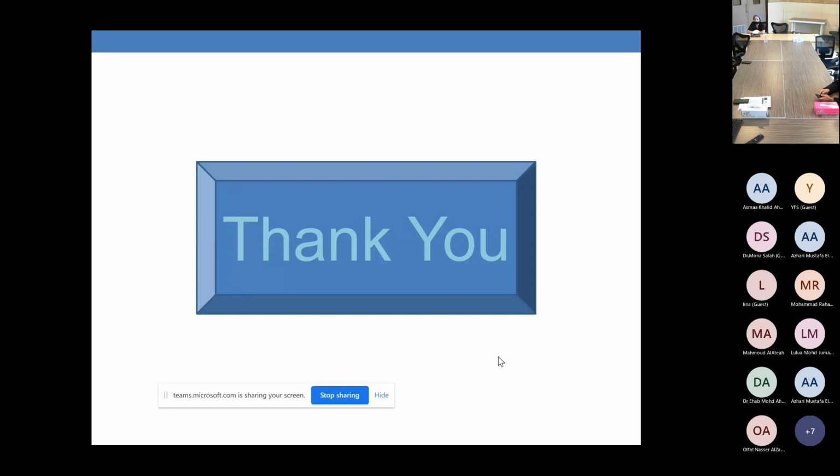What you just mentioned: is it the tube? Is it dislodged? The machine itself. So try to get these graphics, try to look at the waveform and try to reach a diagnosis. Because when you come to the baby and you don't know what's going on, sometimes you could do a little bit more harm than benefit because you lost that important information. So whoever was attending the baby, try to get that information. What was the ventilator showing, if the people need to disconnect the baby from the ventilator.